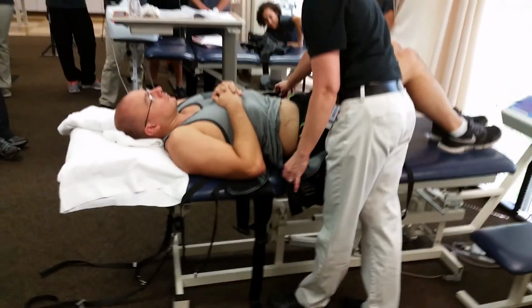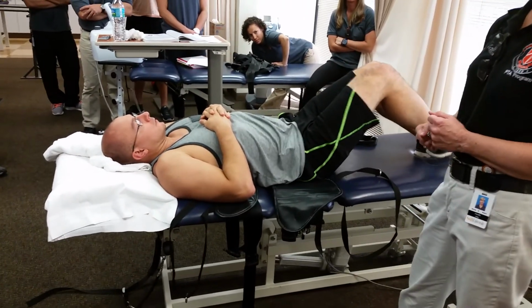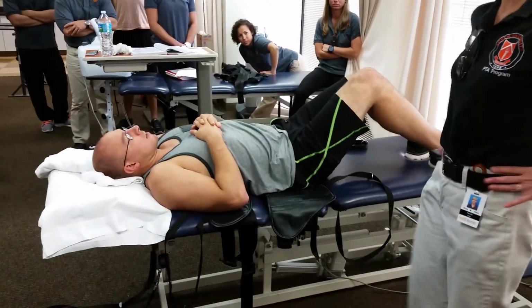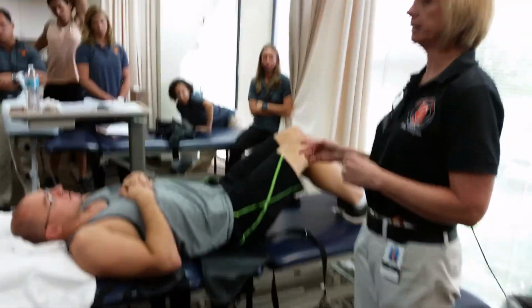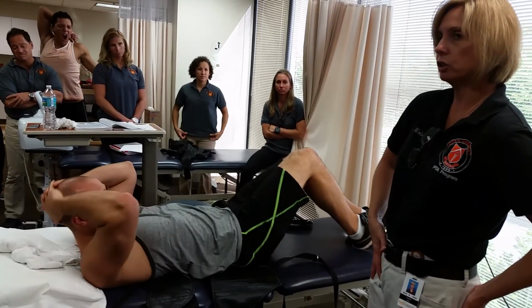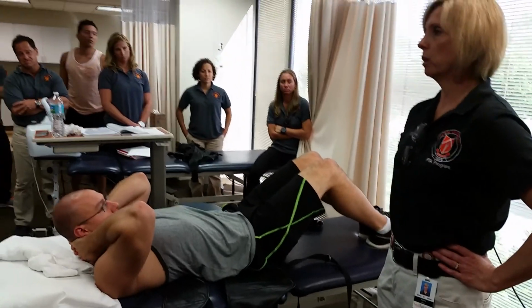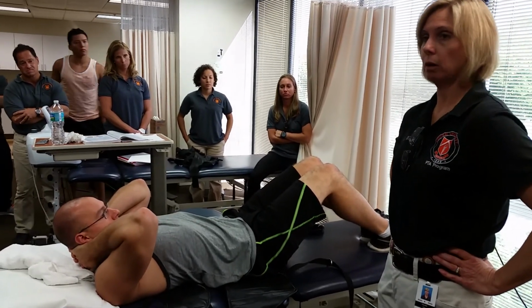And so in the end, if you're going to do a good traction treatment, you're better off doing it standing, because now you know you have it on where it's symmetrical and it's pulling. And I have actually seen patients on traction with one side pulling way forward, and what is it doing? It's actually twisting them, right? Usually you don't want to twist a disc if it's a disc problem.